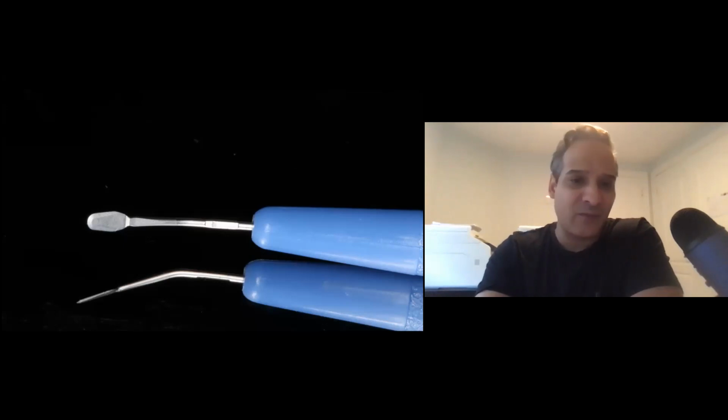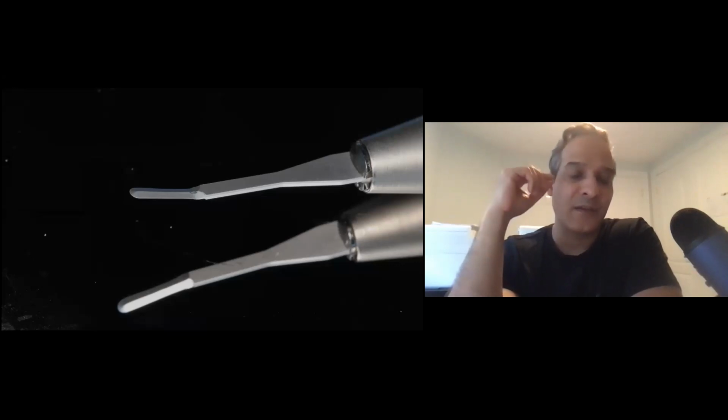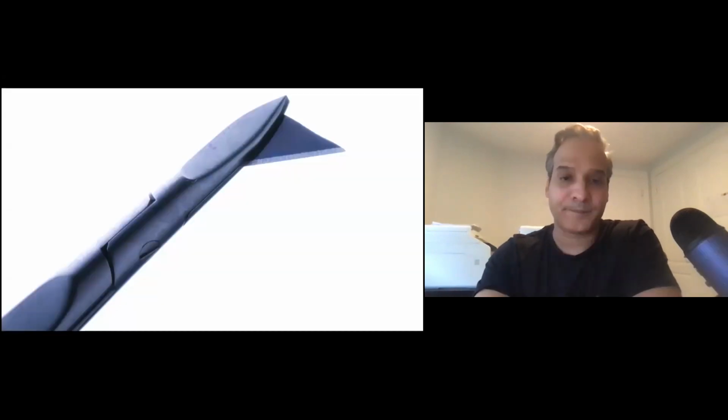This is a really nice one. This one and this one here are really nice for doing lingual grafts on lower anteriors, where I just need to have a certain angle. And because they're bendable, they work really well, especially when you can't see the site as well and you're working from a difficult angle. These come really in handy.